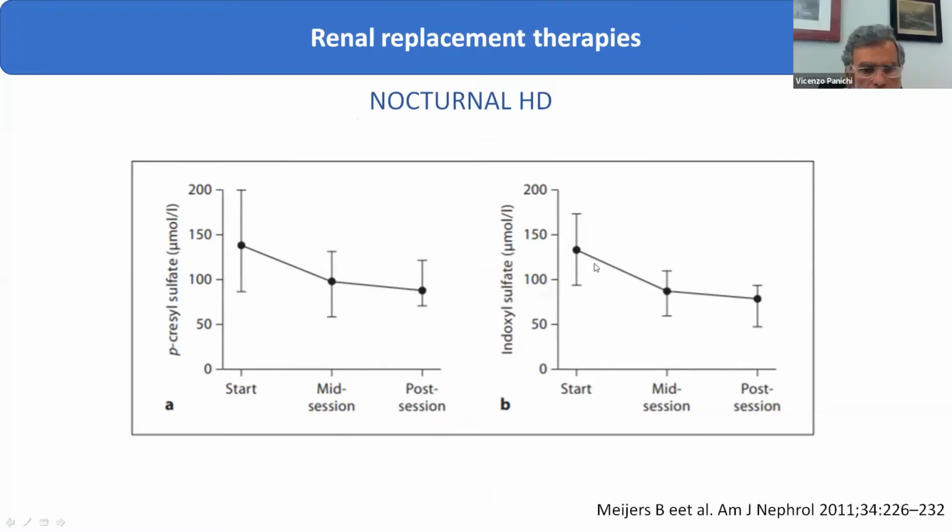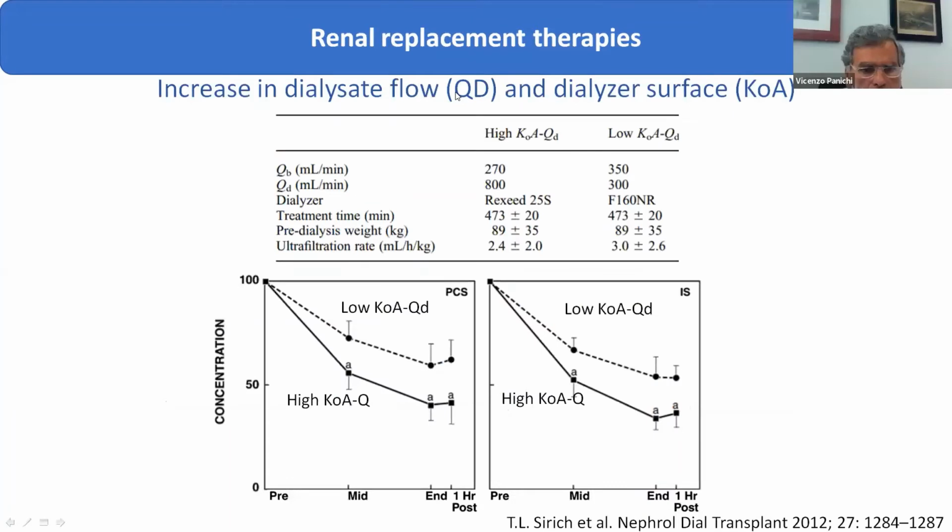So we have tried convective strategies, and adding convection to diffusion is going to increase the reduction of this type of molecules.